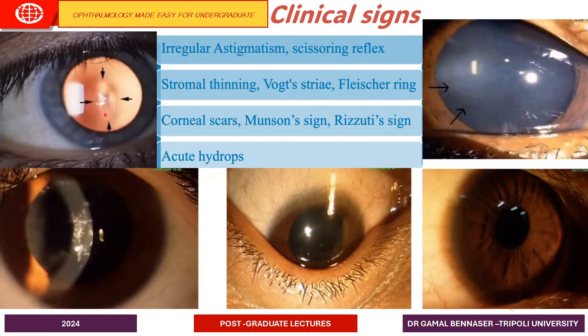When you see by red reflex, you will find what's known as the oil droplet sign. This is also among the early features of keratoconus. Of course, you can see by the slit lamp the stromal thinning and also what's known as Vogt's striae and the Fleischer's ring. We will speak about these in detail.